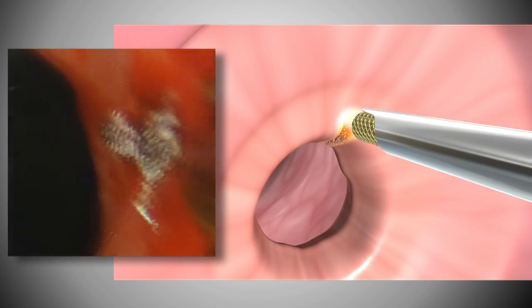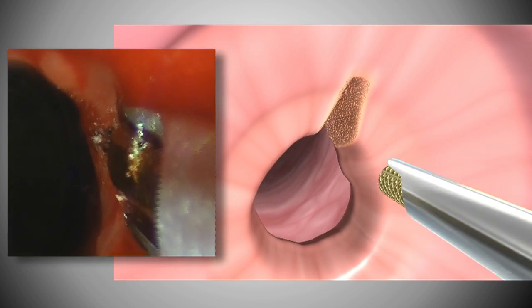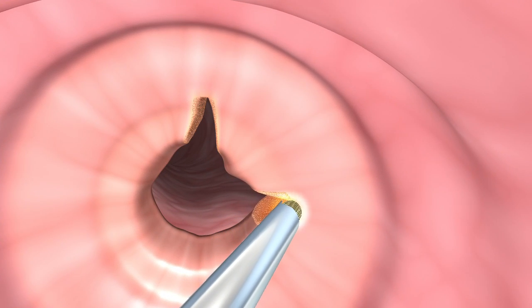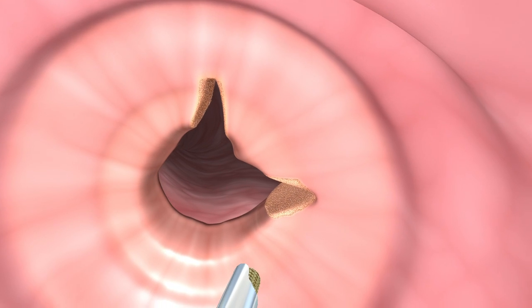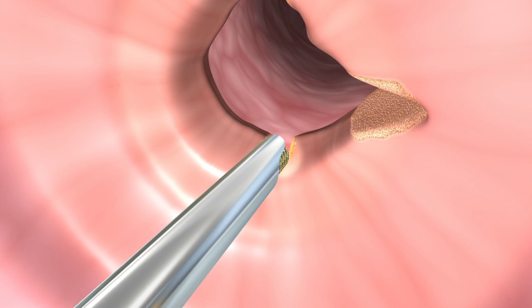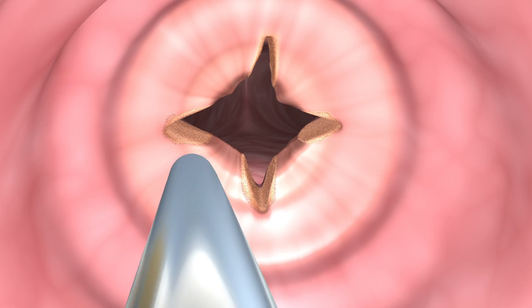So the ideal thing is to make incisions through the scar tissue, but to save as many islands of mucosa that are healthy as possible to serve as the nidus for regrowth, reepithelialization of that tracheal wound. So the temptation should be avoided to actually recreate a circumferential incision.